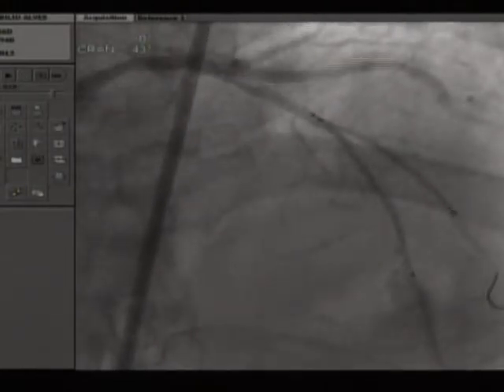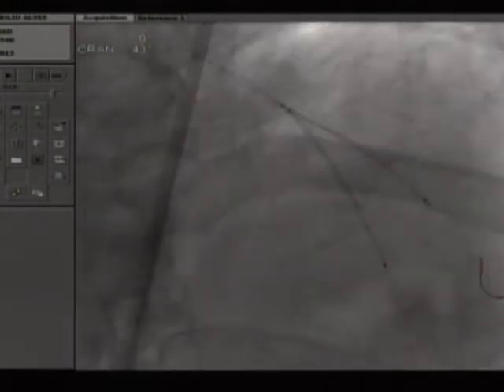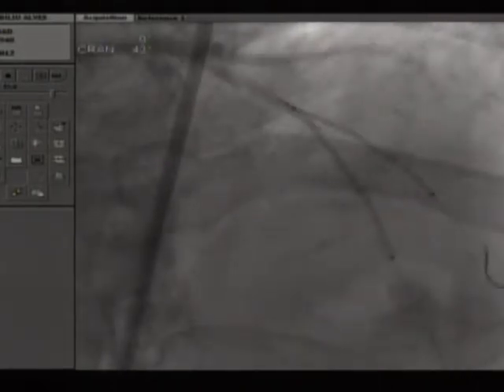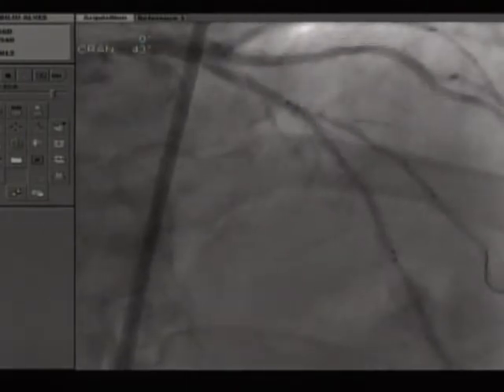So I'm completely comfortable. The point of doing perhaps a more aggressive pre-dilatation when you deal with bifurcation is that you need to take the time to be precise and to do the right deployment.